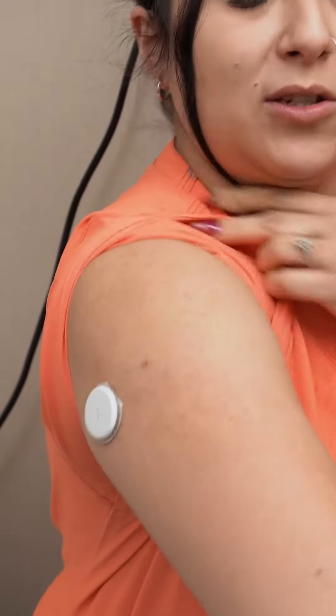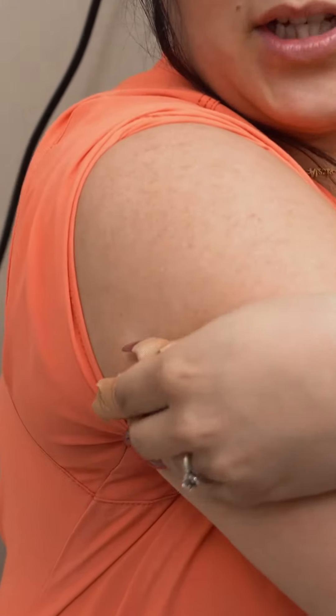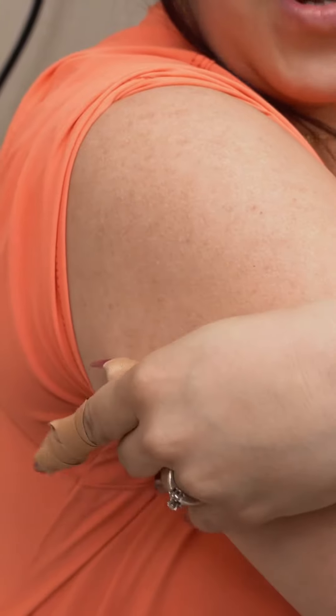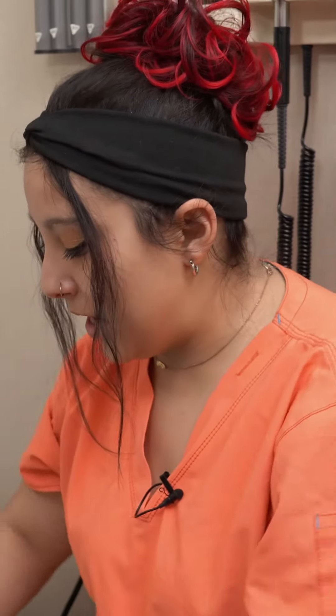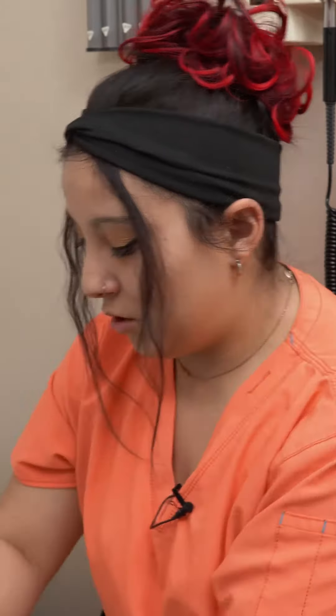Taking off your CGM is going to be super simple. You're just going to take your thumb, go under, and pull. Now every two weeks you're going to rotate your sites.